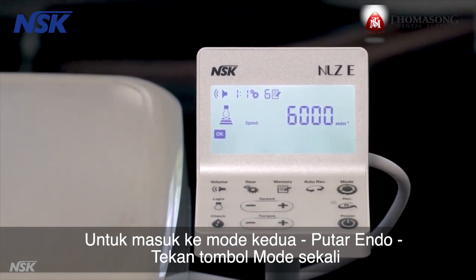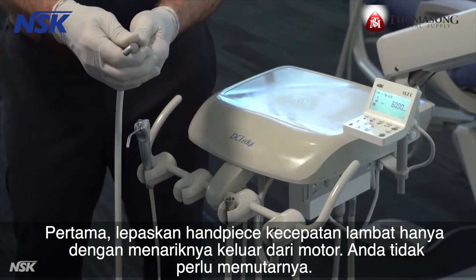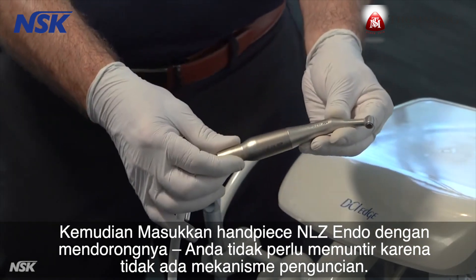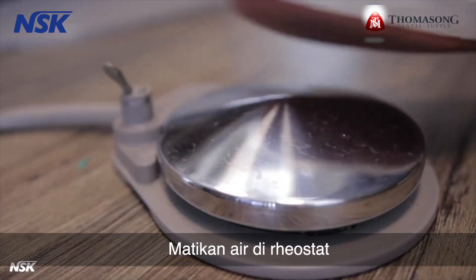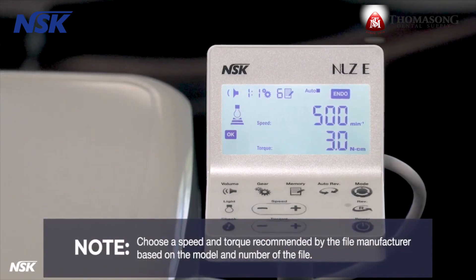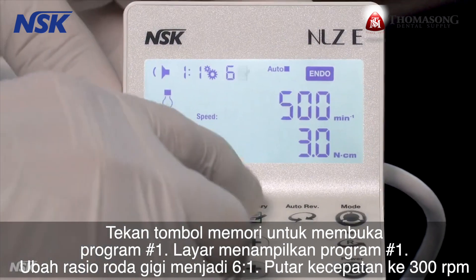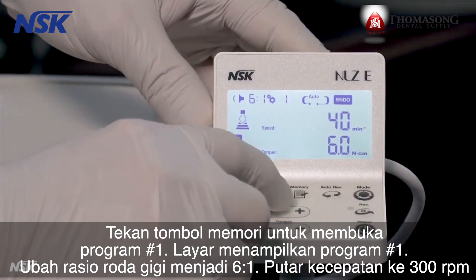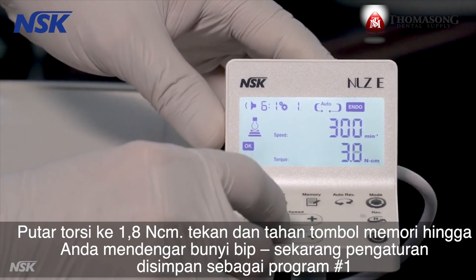To go to endo rotary mode, press the mode button once. Remove the slow speed attachment by simply pulling it out from the motor — you do not need to twist it. Then insert the NLZ endo attachment by pushing it in; you do not need to twist since there is no locking mechanism. Turn off the water on the rheostat. Choose a speed and torque recommended by the file manufacturer based on the model and number of the file. For this demonstration, we'll set up three sample programs. Press the memory button to go to program number one. Change the gear ratio to six to one, dial the speed to 300 RPM, and dial the torque to 1.8 newton centimeters.